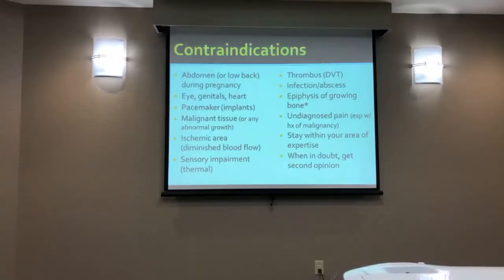If you look at the research, the broad statements from meta-analyses, which I was looking for yesterday and couldn't find, the broad statements are that no, it doesn't work for medial or lateral epicondylitis. The jury has decided that there's just not enough evidence. However, when you encounter people who treat patients firsthand day in and day out, they claim it does.